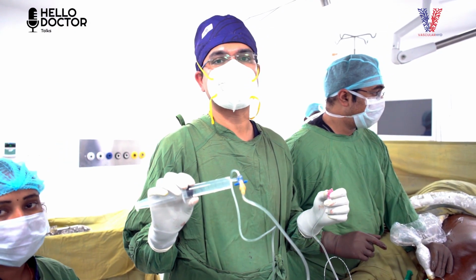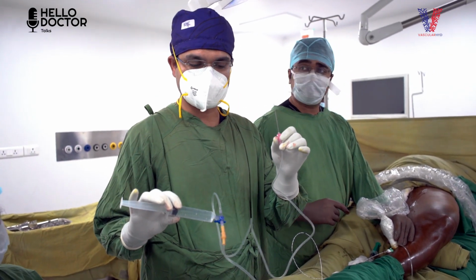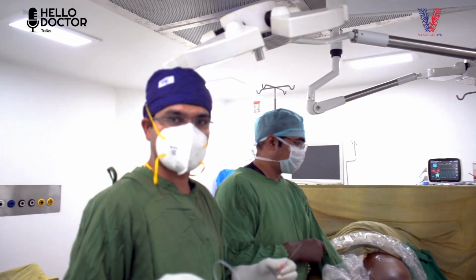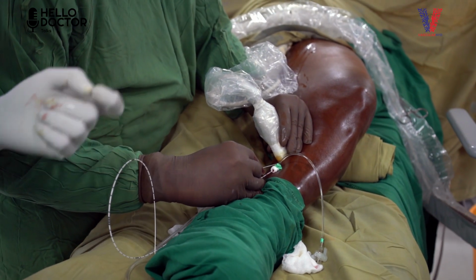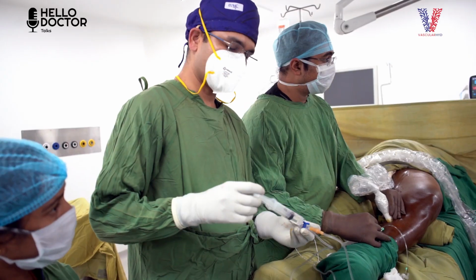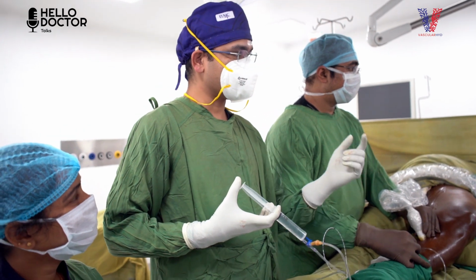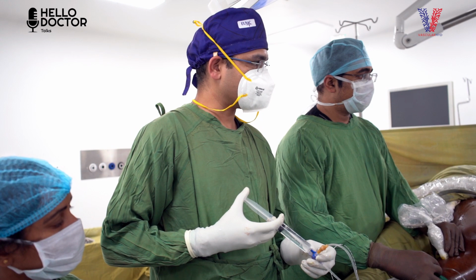This is the setup for giving the tumescent anesthesia. This is a 20 cc syringe with the same 18 gauge puncture needle, and that is connected to an NS bottle in which we give soda bicarb and some local anesthetic with adrenaline. Again, after giving local anesthesia under ultrasound guidance with the help of a puncture needle, this is how we reload it, and then after positioning the needle in the saphenous fascia, confirm it in the ultrasound.